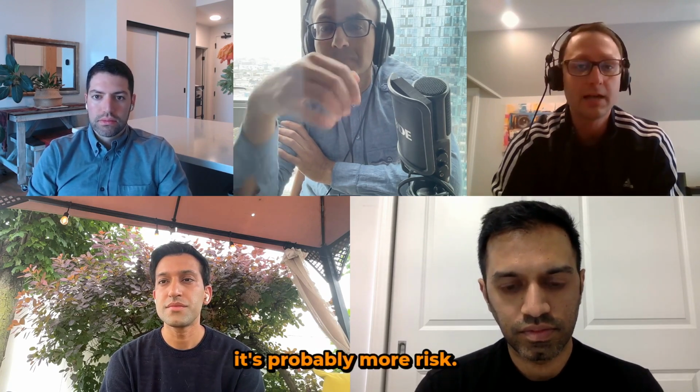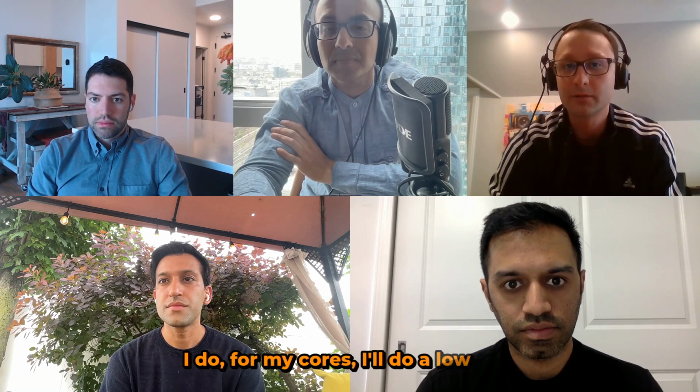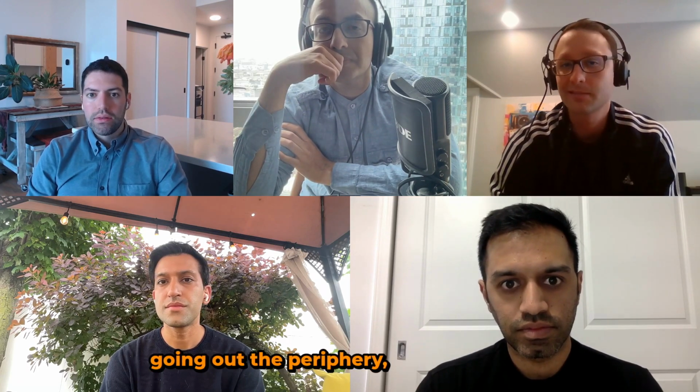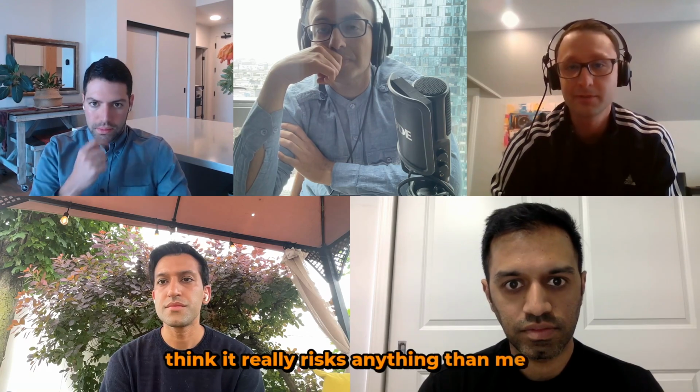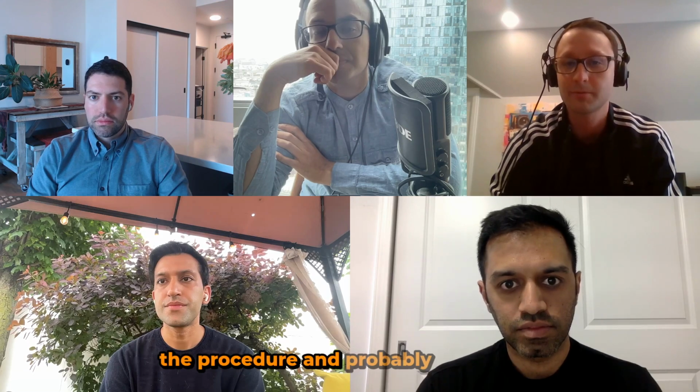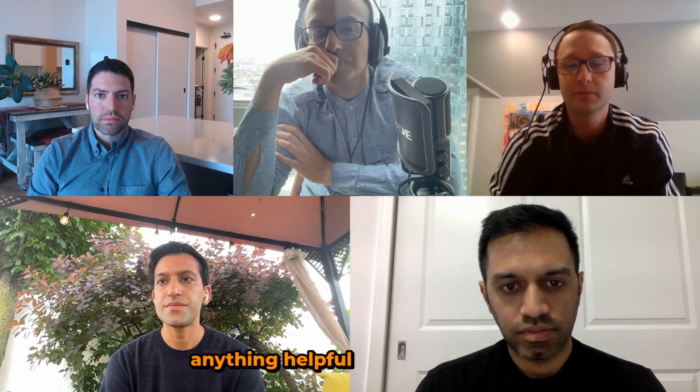It's probably more risk. For my cores, I'll do a low cut rate, like a 400 cut rate, just for the core, and then I'll increase it when I'm going out to the periphery, because I don't think that really risks anything, doing the central core at a lower cut rate. But all the other stuff I think is a nuisance, maybe adding more risk to the procedure and probably not doing anything helpful in terms of the pathology.